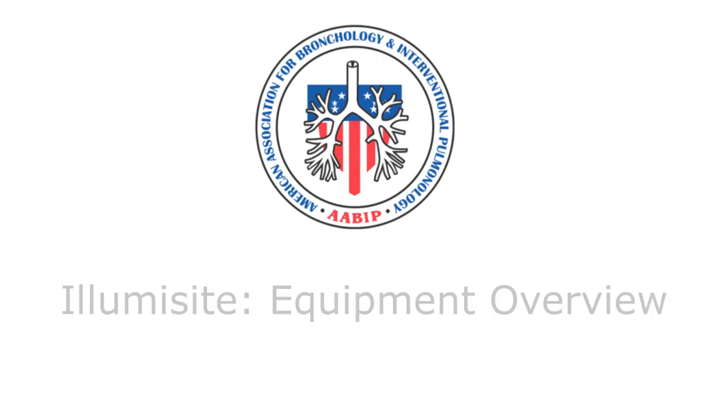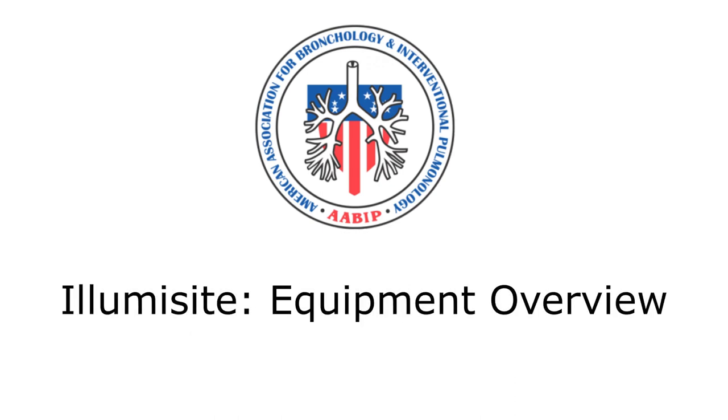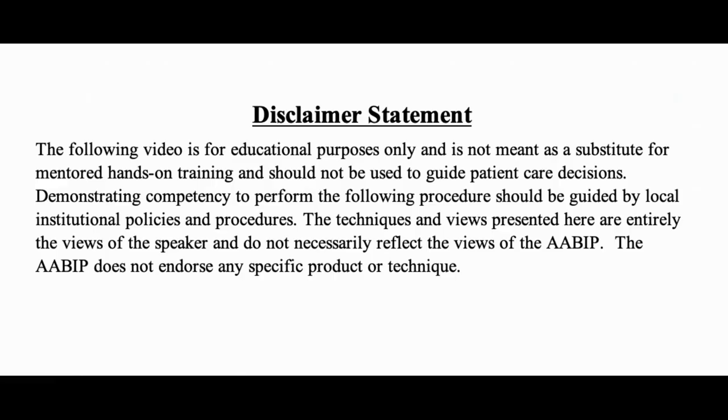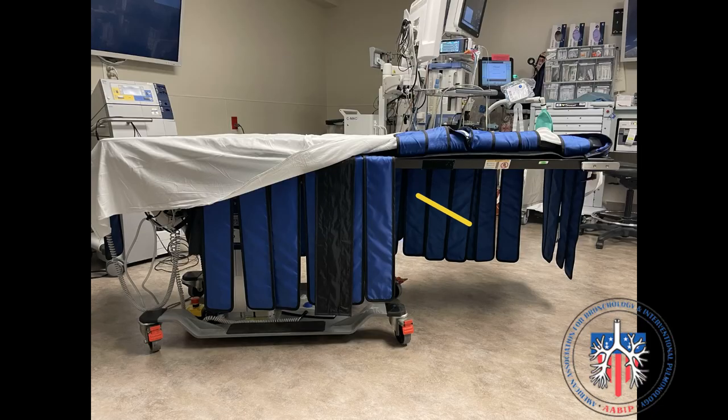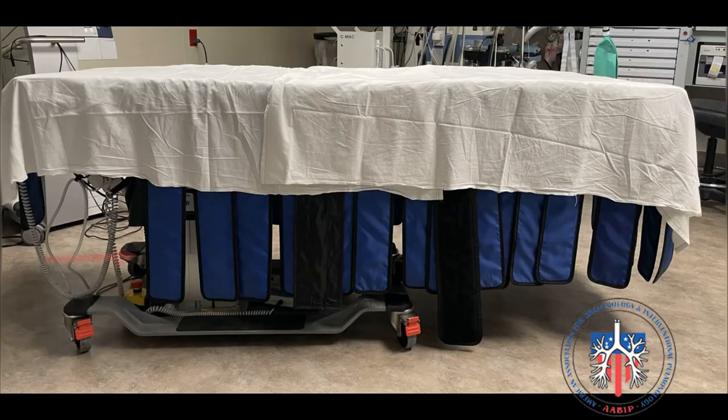AABIP Video Educational Series — AlumiSight Equipment Overview. Procedure bed requirements: the procedure bed should not have any obstruction underneath the center to head of the bed. This will allow the C-arm to come fully under the bed and image all areas of the thorax. These blue lead aprons provide additional protection from radiation scatter.